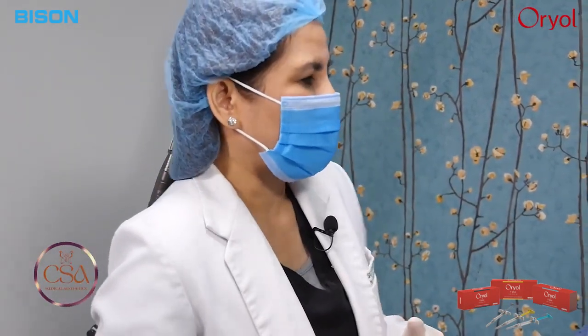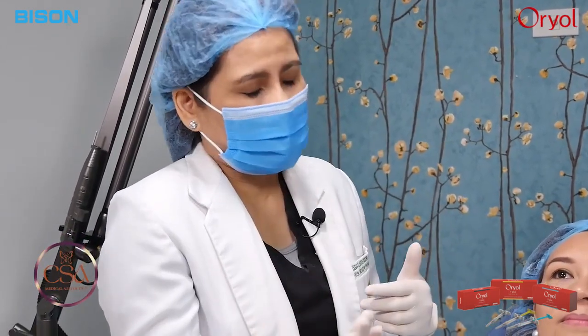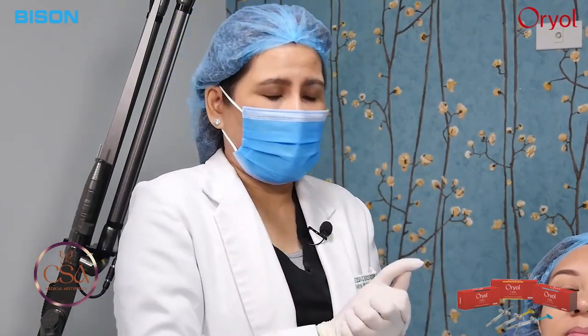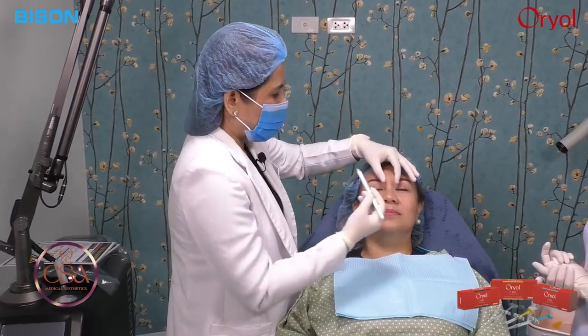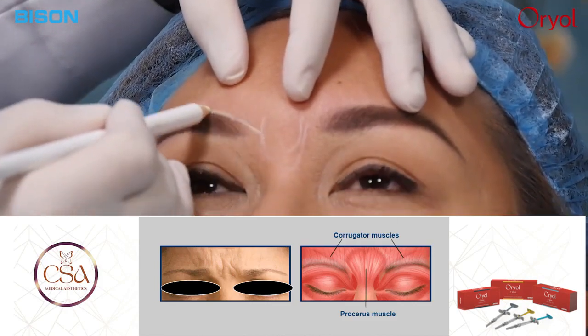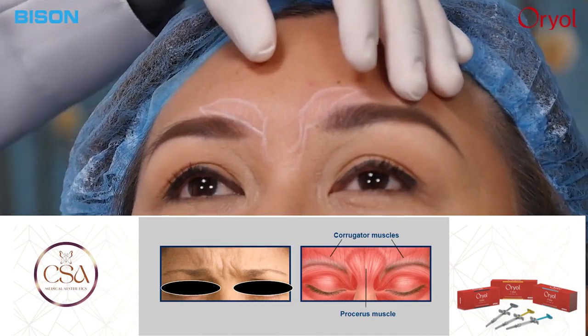We are now about to perform the correction of the glabellar static line, okay? Before doing the injection, we have to do some anatomy review here, okay? So a while ago, we were discussing the types of dynamic and static lines, what the difference is, what the primary treatment is, and some assessment there. And of course, we also included the cause of those kinds of lines, okay? For now, a bit of an anatomy review. In terms of the muscles in this area, we have here the center muscle, the procerus. And then on the sides are your corrugator muscles. So these are the ones we treat with our neurotoxin or botulinum toxin, okay?